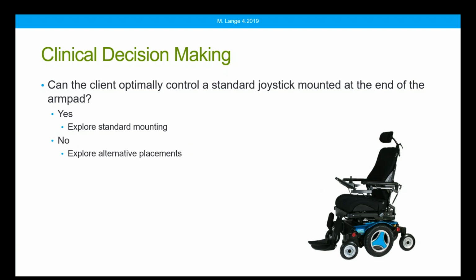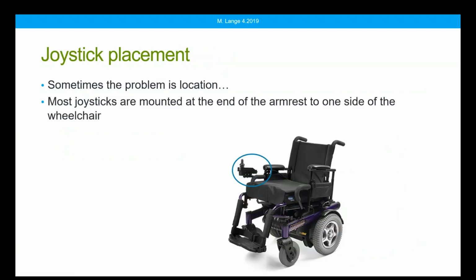We next have to see, can the client optimally control a standard joystick that is mounted at the end of the arm pad? If yes, we can typically explore a standard joystick. If no, we may have to explore alternative placements.